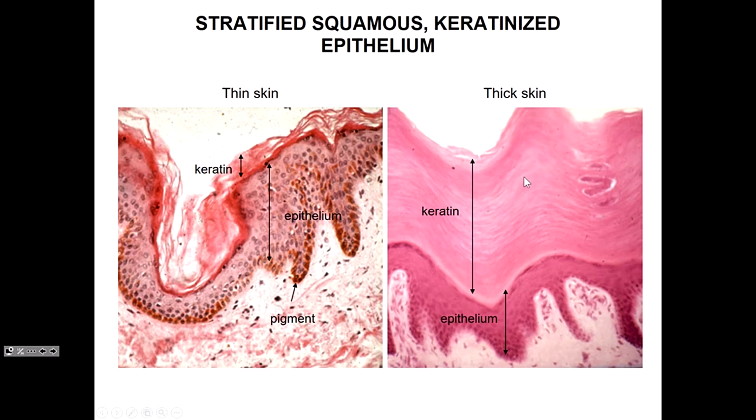Yes, they move up. So these cells down here are mitotic, and then they slowly move up, and when they get to this level they die and become the keratinized dead squames that we see there. I will go over that in great detail when I do the integument lecture. I think it must be next month. Other questions?